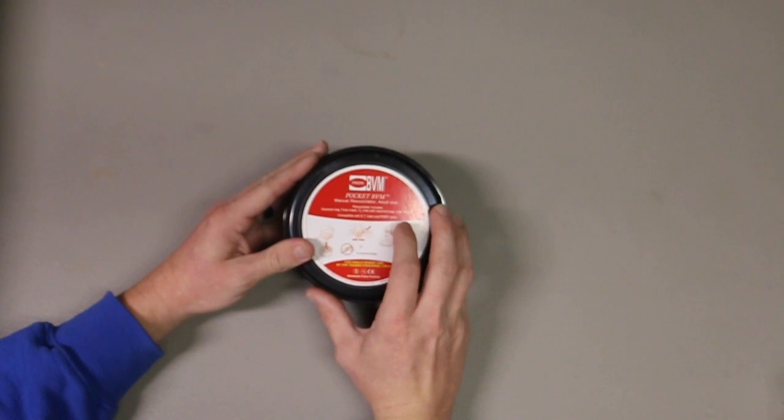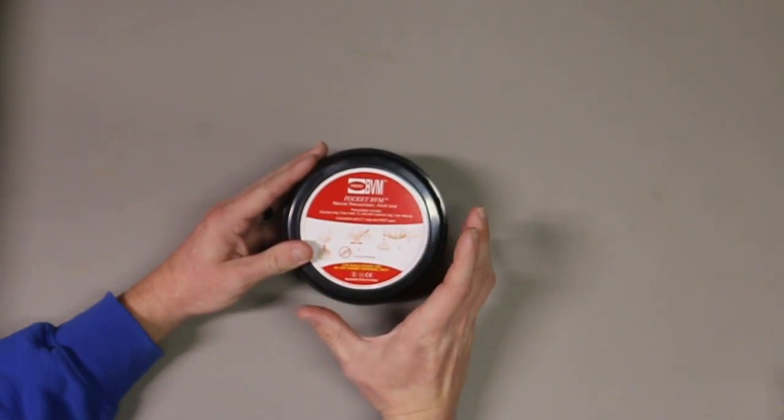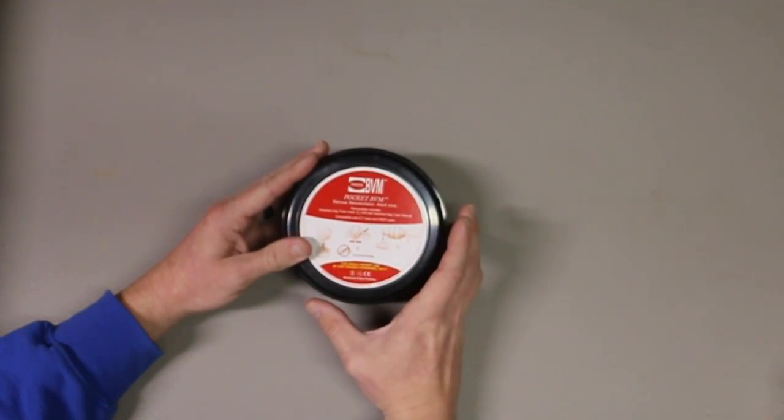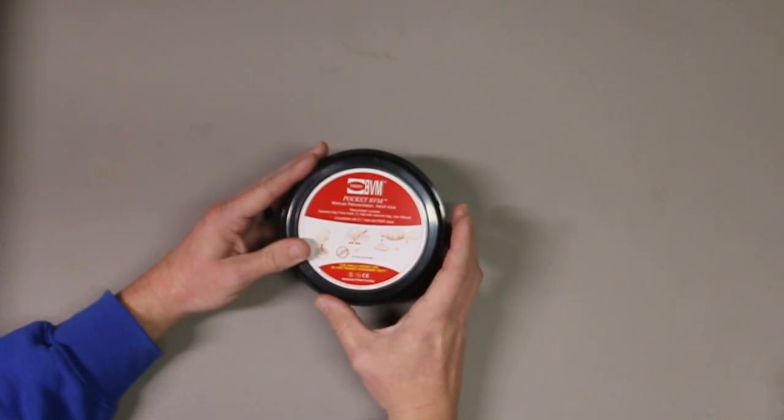This is called a Pocket BVM. This is used as a bag valve mask on an adult patient that is not breathing well, not breathing adequately, then we can provide some support for them.